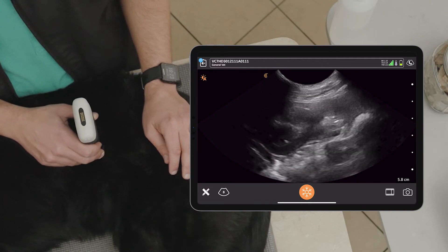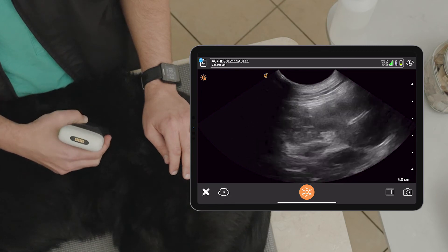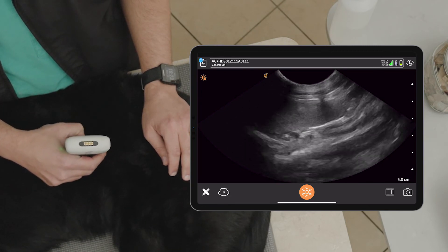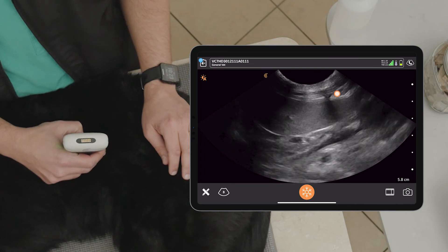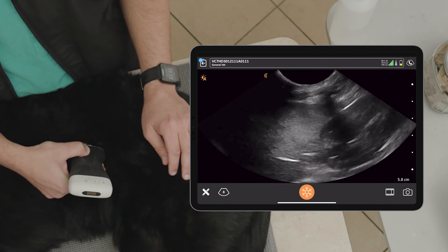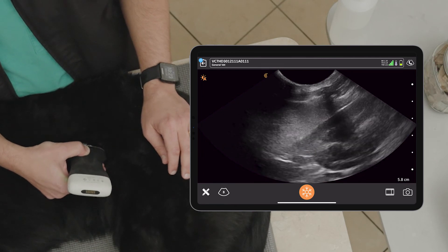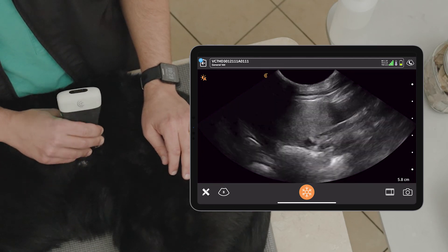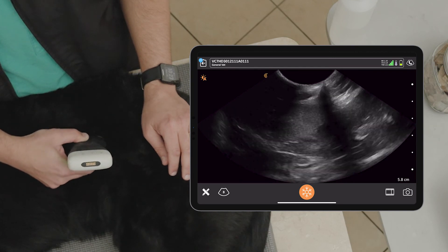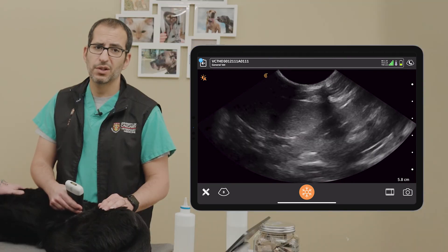We're also seeing the spleen come in here, Dr. Boison. This is the left paralumbar site, and we often find a tail of the spleen here. When we fan through that — there it is, beautifully demonstrated — we want to look for free fluid between the kidney and the spleen, as you see here, or surrounding that spleen at this site. This complements the umbilical site we talked about earlier very nicely when it comes to looking for free fluid. And that is the left paralumbar site.